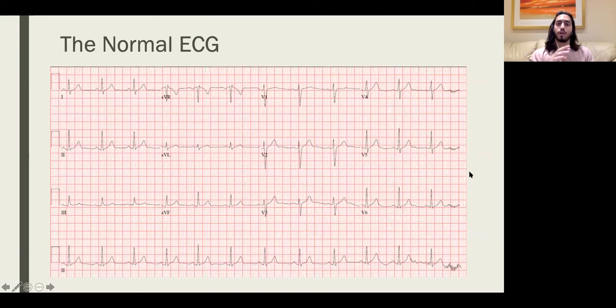So we've gone through what an ECG actually looks like in terms of what these waves represent. We know that this P wave represents atrial depolarization. We know that the PR segment is while the action potential is going to the AV node and it's just staying in the AV node a bit. QRS complex, big ventricular dipole. ST segment, waiting for repolarization. T wave, complete repolarization. Have a good look at this ECG, because this is the perfect normal ECG.